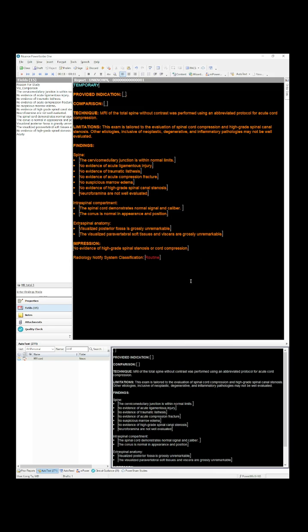Okay, so I've really come to find that the template and the tools you use make a huge difference in the readability of reports. They make a huge difference in the efficiency of reporting, and frankly, the ability to handle the list. I see this every day with our fellows and colleagues who have spent more time investing in that tool set.